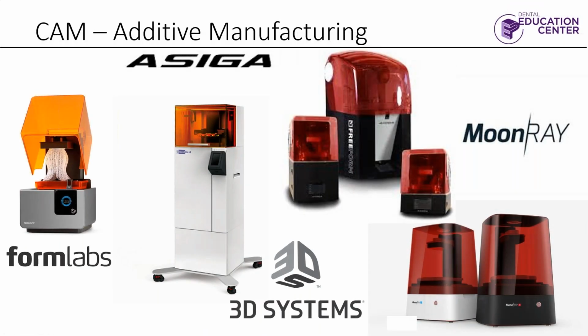Printing, I didn't really spend a lot of time with printing, but there's a lot of printers out there. The SLAs like Formlabs tend to be a little slower. I know Dr. Shank's got a couple of printers. He has the 5100. And which one did you buy, Dr. Shank? What was the other one? I've got an Asiga Max. The Asiga. Okay. You've had pretty good luck with that? You like it? So far, yeah, I have.